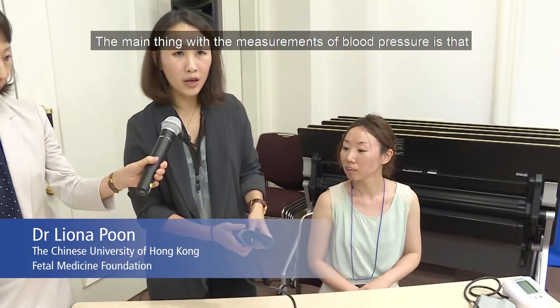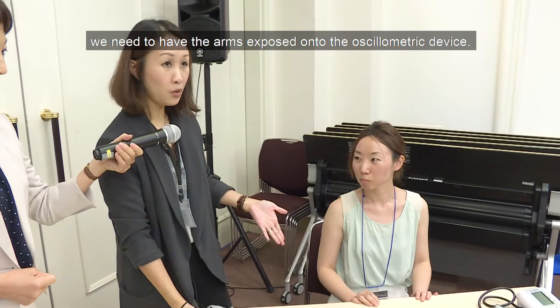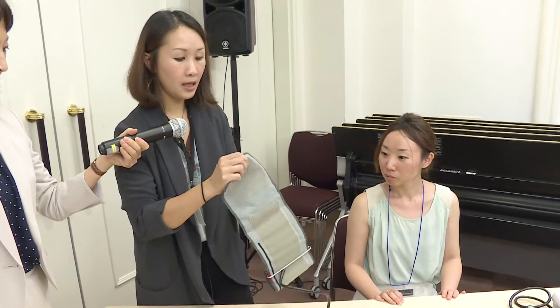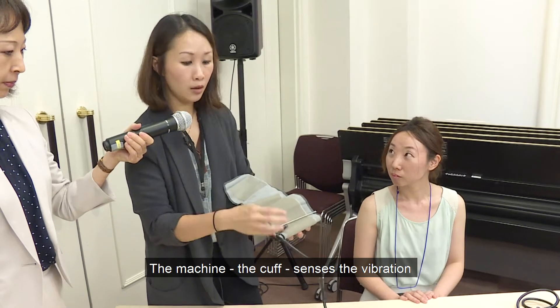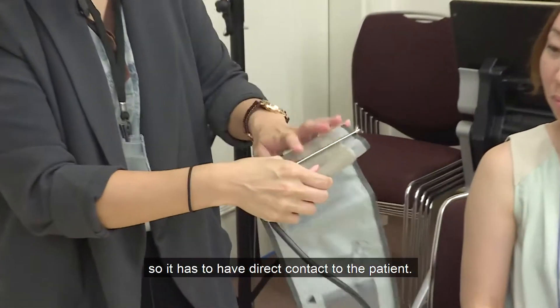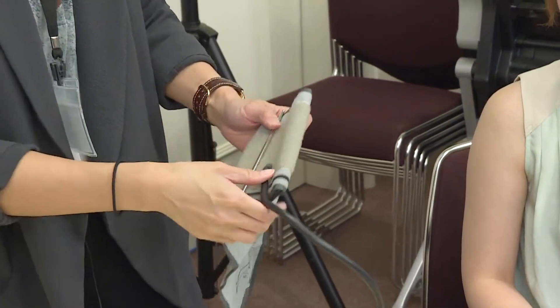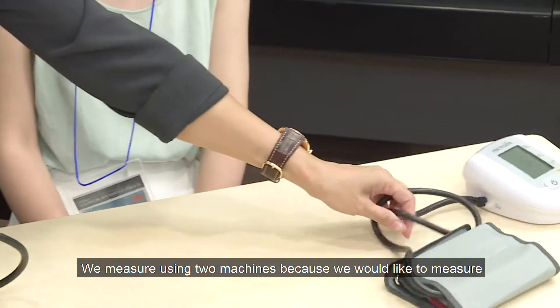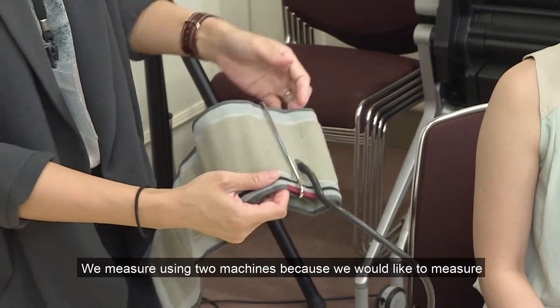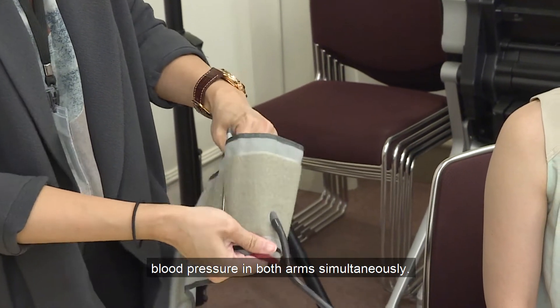The main thing for blood pressure measurement is that we need to have the arms exposed. It's an oscillometric device, meaning that the machine, the cuff, sends the vibration, so it has to have direct contact with the patient. We measure using two machines because we would like to measure blood pressure in both arms simultaneously.